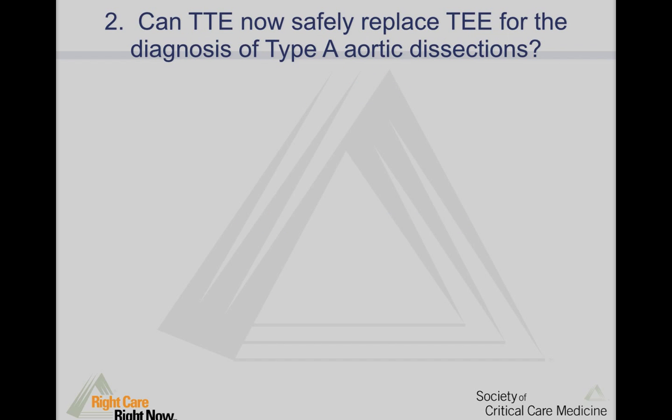And then lastly, can TTE replace a TEE? I think we know the answer to this is no. That study shows that there are studies being done looking at it. Again, if you see it, it should heighten your suspicion. So just keep in mind doing these tests on patients that you have a suspicion for dissection. And if you see it, great. Let it lead your next test of choice and let it lead some of your consultations and clinical bedside management.